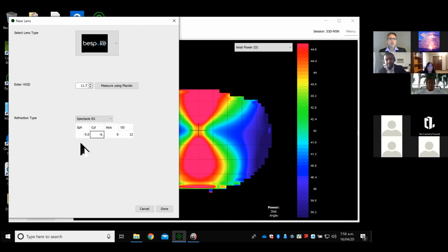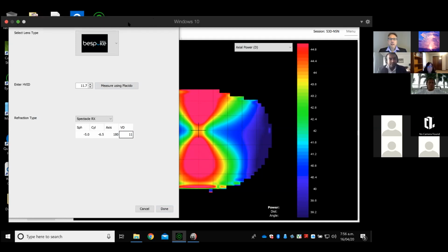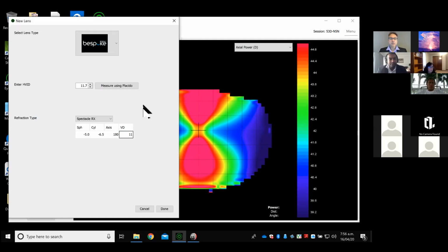So the comfort level is again a lot better and the vision's instantly there. So the first experience is much, much better than trying to fit a number of diagnostic lenses onto the eye. You put an anesthetic in, it's in, out, in, out. So the patient expectation lowers on that first day of fitting. So we find this to be a really nice tool for doing those high toric cases.